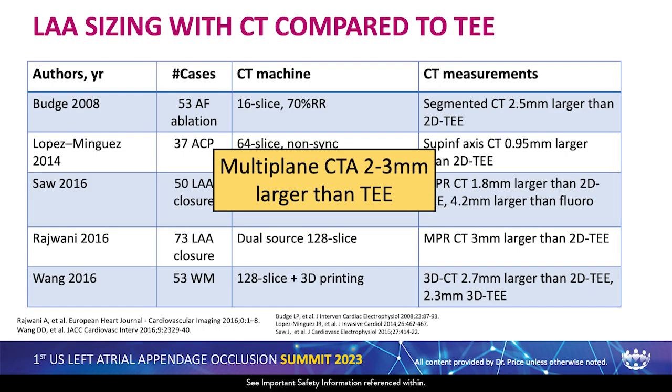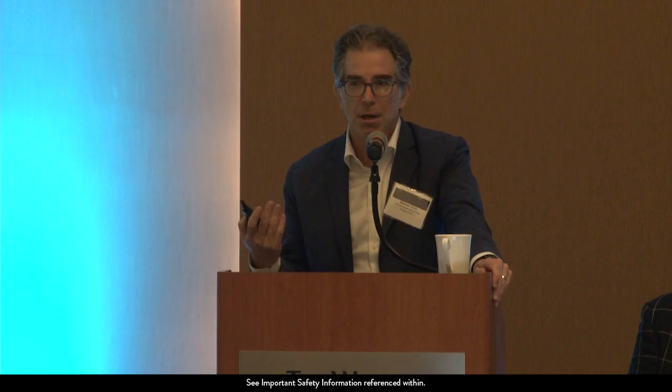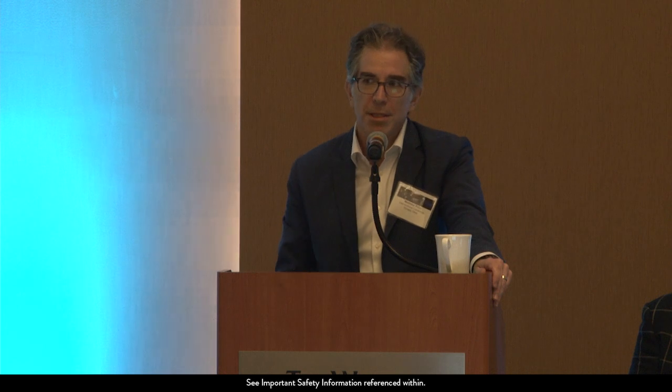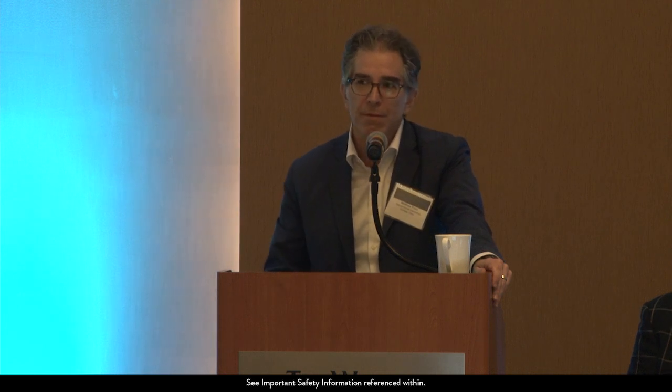So there is data. This is the only data slide I think I have. There have been plenty of studies comparing sizing of the LAA with CT compared to TEE. And no matter how you slice it, pun intended, you find with CT that you get about a 2 or 3 millimeter larger diameter than with TEE, which makes sense. One, the patients are generally not NPO for half the day, and two, you get better resolution with CT. So I think this is an important thing. And CT gives you what's there.